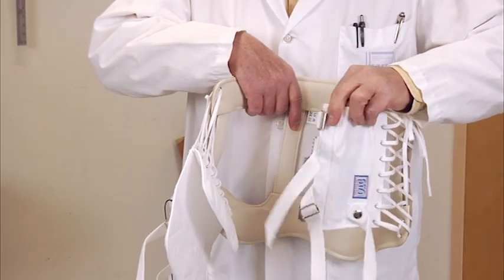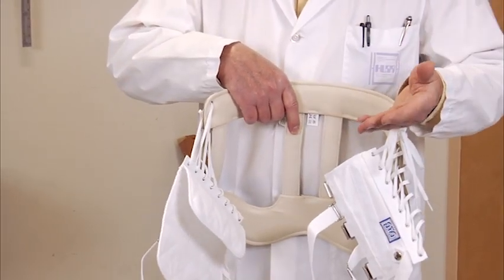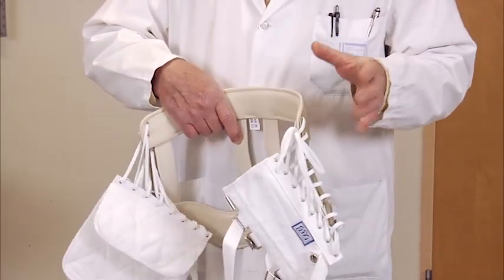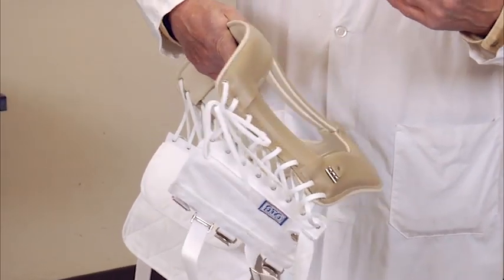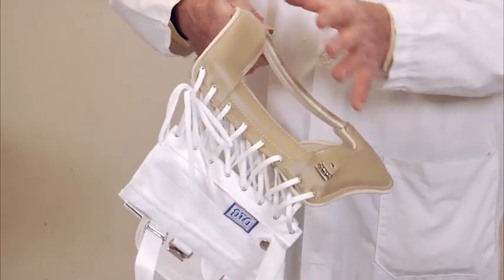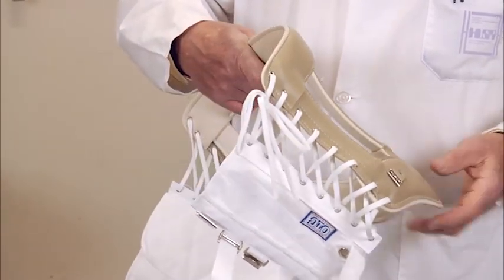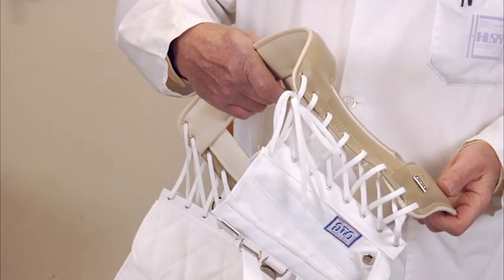On the front, we have either a hook closure or a Velcro closure. Regardless of the type of closure on the front, the idea behind the brace is simply to use hydrostatic pressure to contain the brace and use the frame of the brace as a rigid back, giving us support for whatever section of the spine is being worked on.